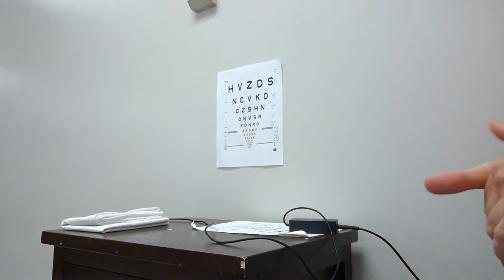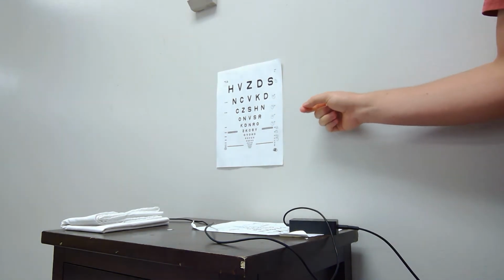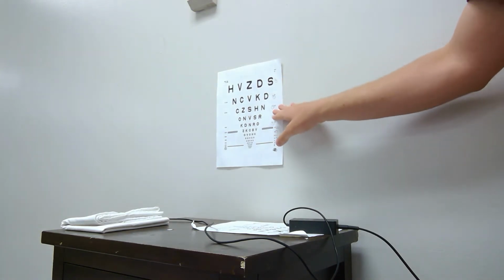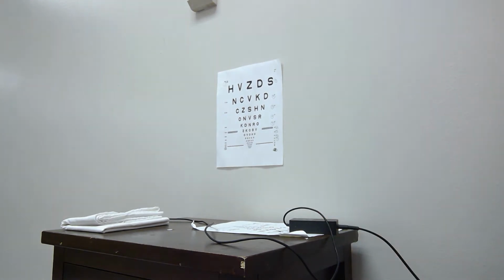This next test is the Dynamic Visual Acuity test, or the DVA. For this test, we're going to be using an eye chart called an ETDRS eye chart. What's unique about these is that they have the same number of optotypes on each line, so same number of letters, which is different than your classic Snellen chart you might see at the eye doctor.